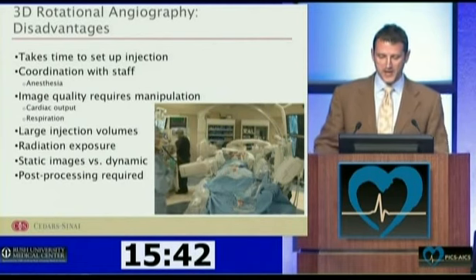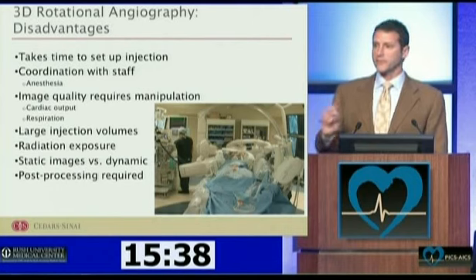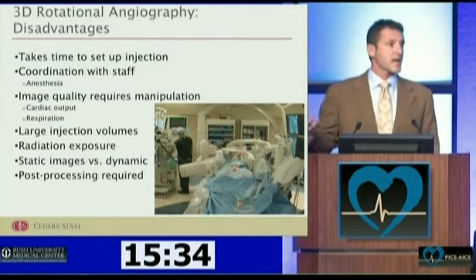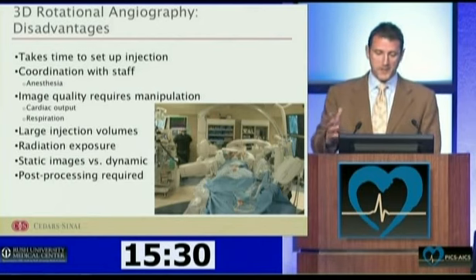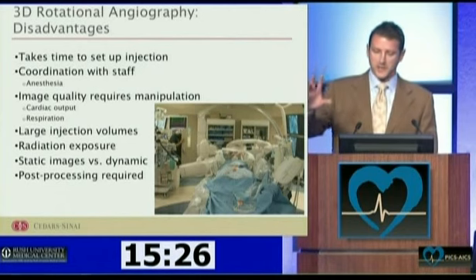The guy in black is our anesthesiologist. He is turning off the ventilator. You can see, for whoever was asking, how far are people away from the patient? Far. There is scatter with this. The flat panel detector is way off the patient. He is literally leaving the room. We're good with that. They do it all the time. It's either that or playing a lot of solitaire, so we're okay with that.